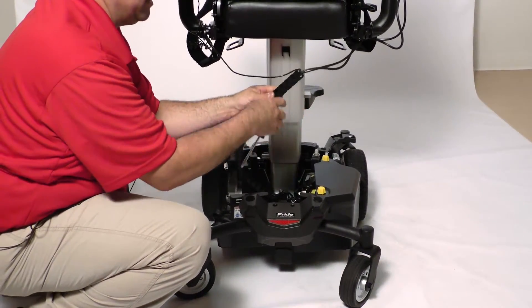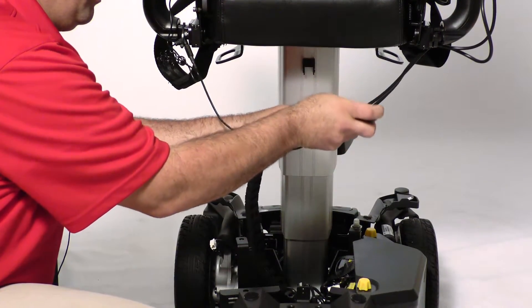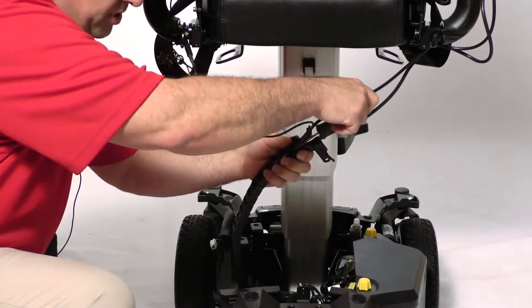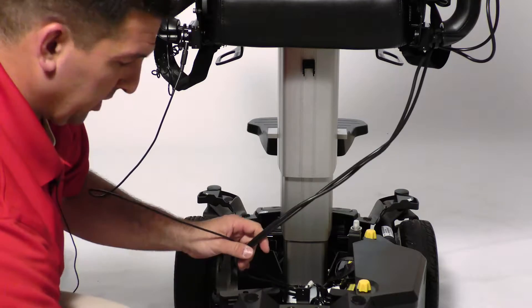Now you will be able to access the zipper part of the chain. Just take your straight slot screwdriver and carefully reach it in and pop one side of the chain off. Remove your harness from the chain.